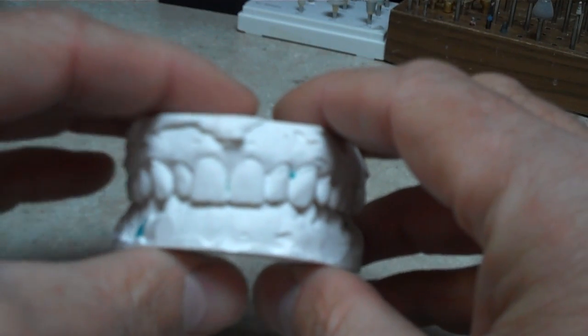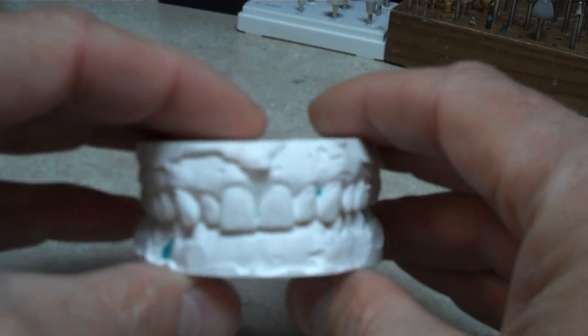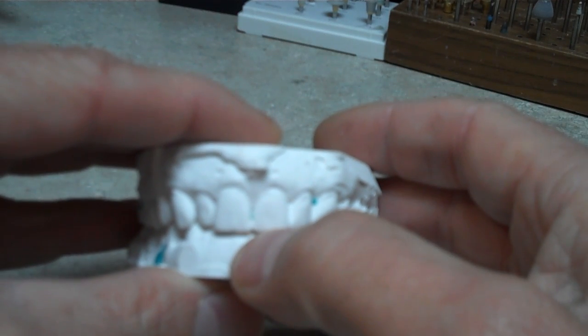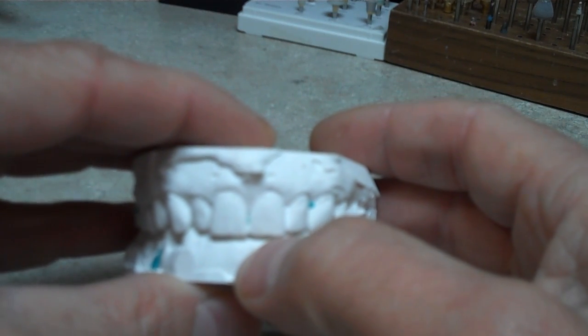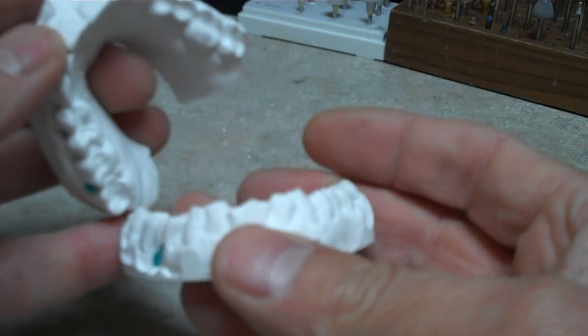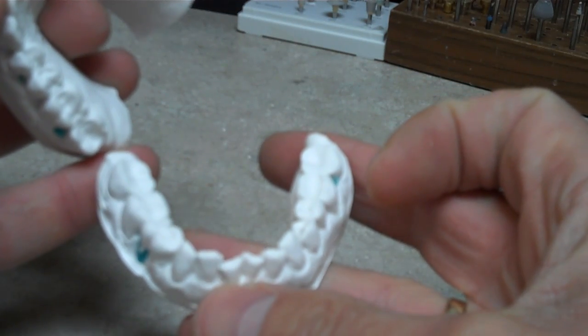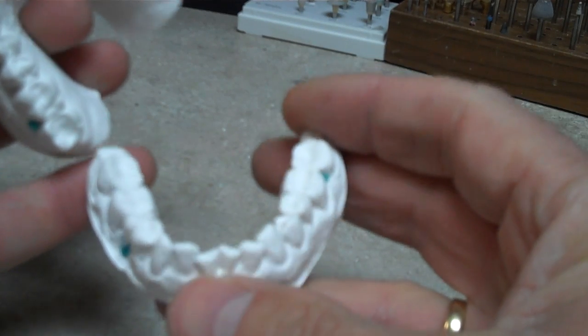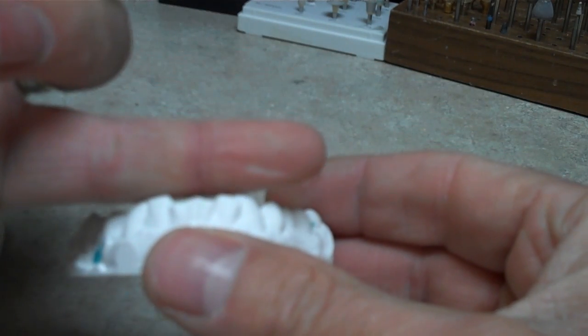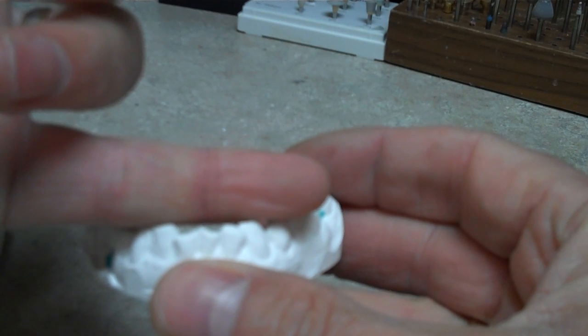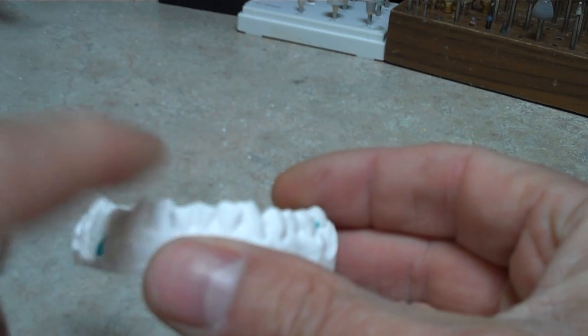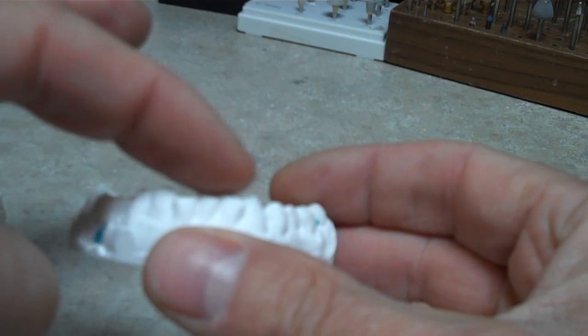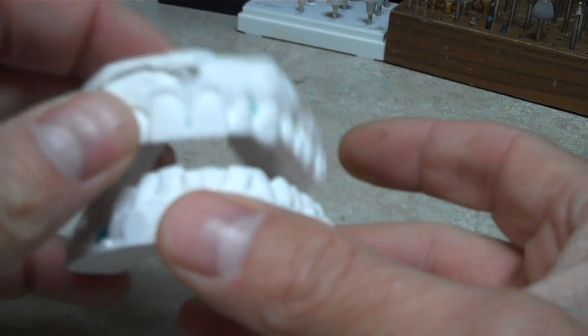With this case, as you can see here a bit closer up, we have a 100% overlap, more or less, and some pretty extreme wear and crowding on the lower anteriors with a very uneven anterior incisal plane, where it will be quite difficult to get an anterior midpoint stop fabricated with the current setup.